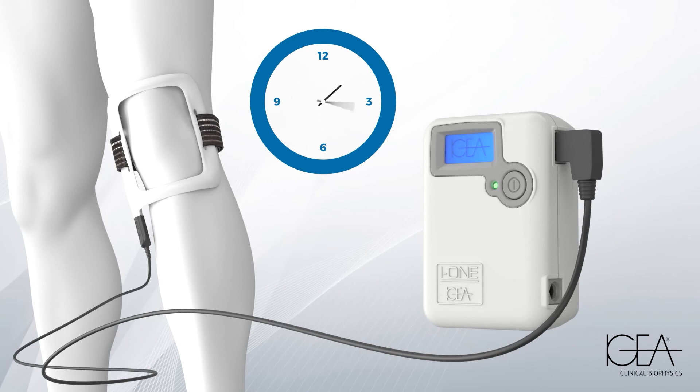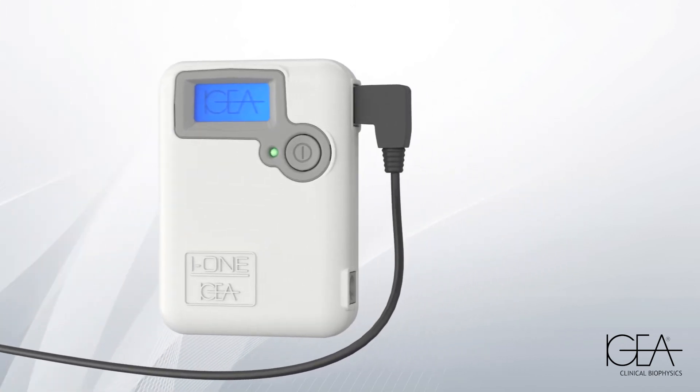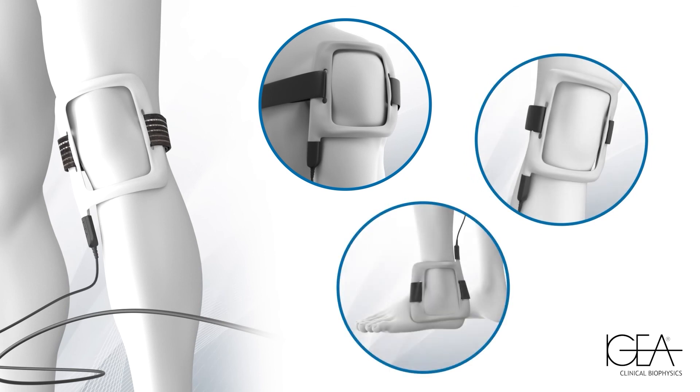After four hours the device stops delivering the therapy and remains in standby. The treatment can be divided into two sessions of two hours each, and it can also be done overnight. It is possible to apply I1 TPC on any joint, from the knee to the foot.